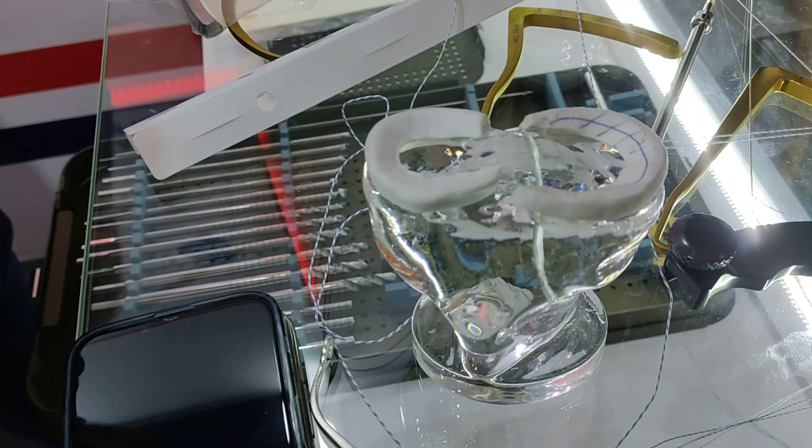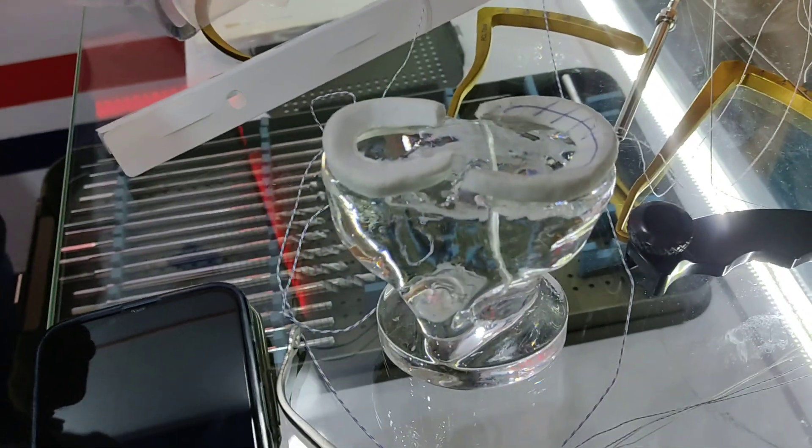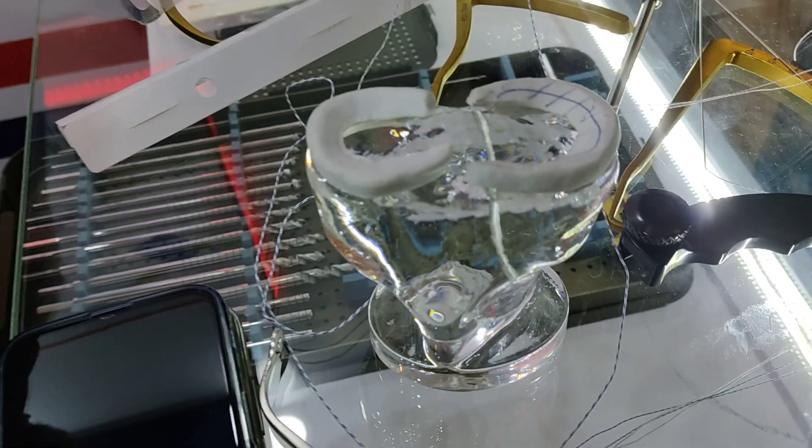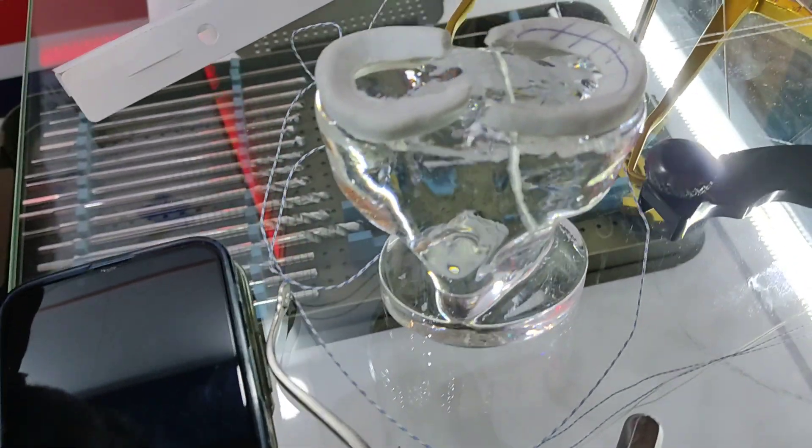This is number zero ultra, which is very strong. The only thing we need to take care is the nerves and the vessels on the posterior side, so you need to expose it nicely.